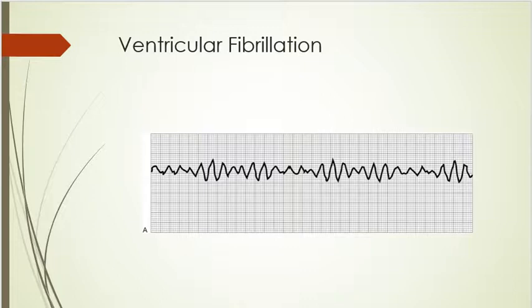Okay. This, my friends, is VFib. And this is coarse VFib. It's very, very easy to see. Sometimes you'll have fine VFib, where it's very, very fine, and it'll look like they're off the monitor sometimes. So if they're yelling that your patient's off the monitor, don't just walk, run.